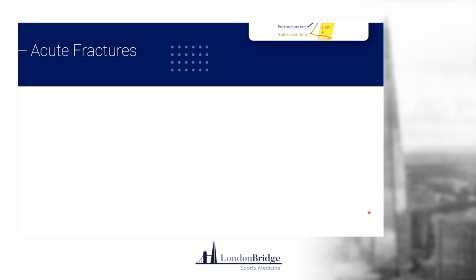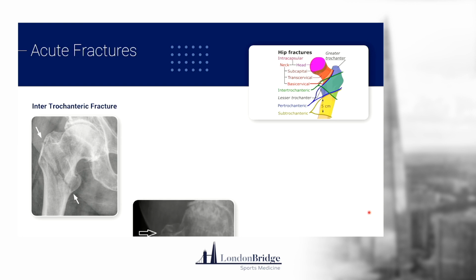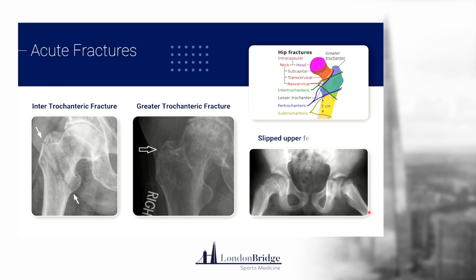X-ray is also useful, like we talked about, in the acute setting for fractures. So we're all, from our A&E days, I don't know if anyone's still in A&E, but we're all a bit worried about intracapsular stuff. We think, okay, intracapsular fractures generally aren't healing as well, so we want to make sure they are looked after a bit better. Whereas, on the other hand, some greater trochanteric fractures can be managed in the outpatient setting and in the community. And that's not just more elderly patients, that's young people as well. So X-ray is really useful from that.